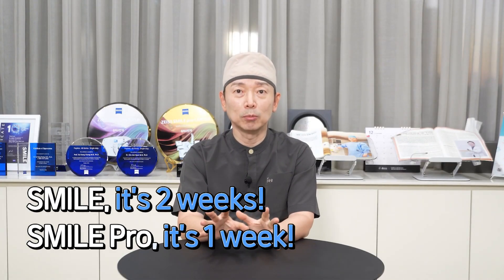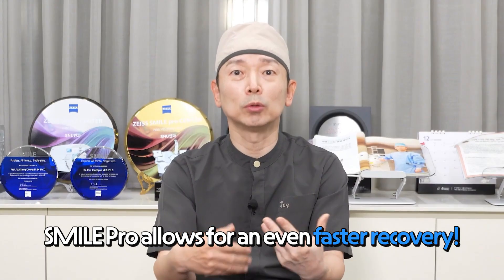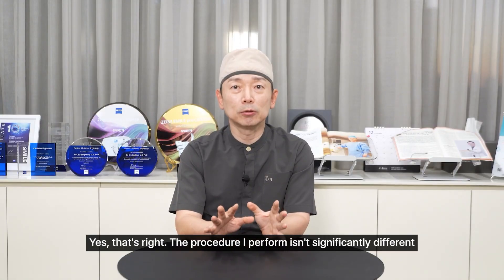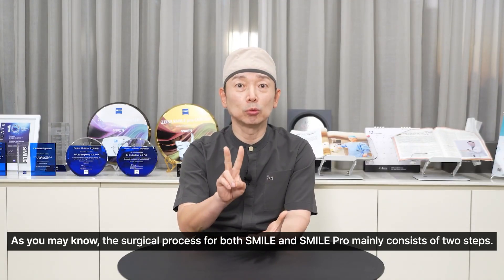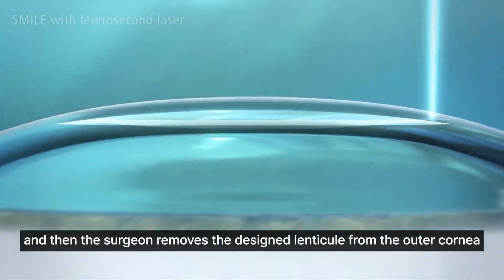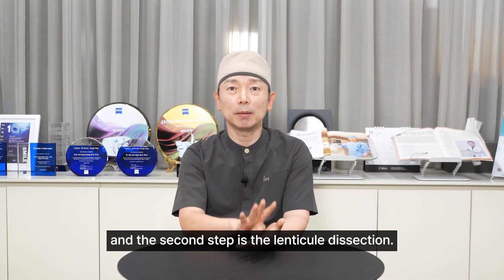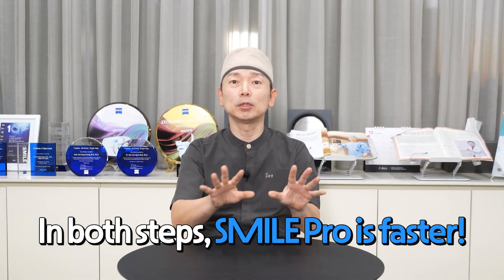For Smile, it's about two weeks and for SmilePro about one week — that's the general precaution period I recommend, as it's a procedure that allows for relatively fast recovery. The surgical process for both Smile and SmilePro consists of two main steps: we use a laser to treat both the front and back surfaces of the lenticule, and then the surgeon removes the designed lenticule from the outer cornea using a specialized instrument, called lenticule dissection. Both steps are a bit faster with SmilePro.